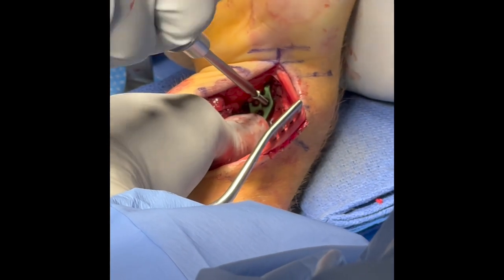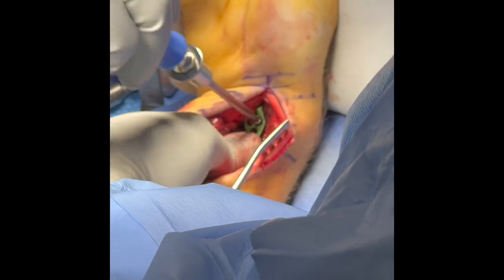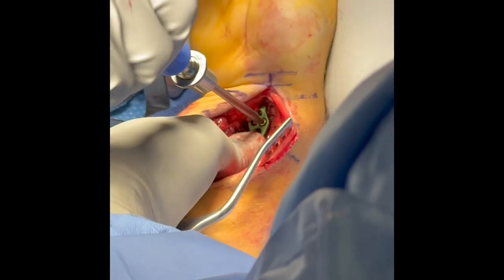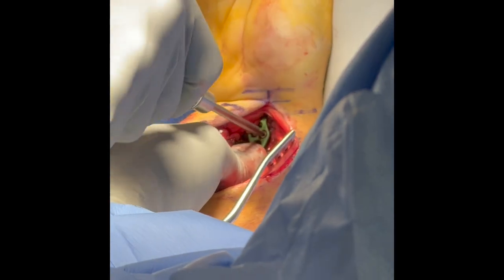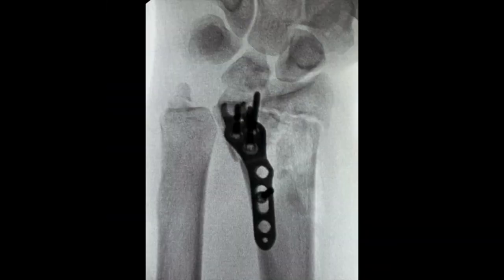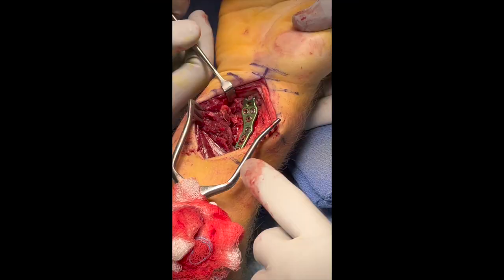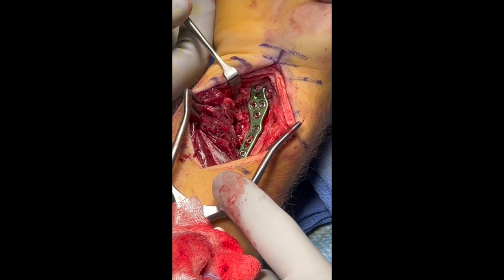Here the distal screws are being placed, and the remainder of the screws are placed in the plate.